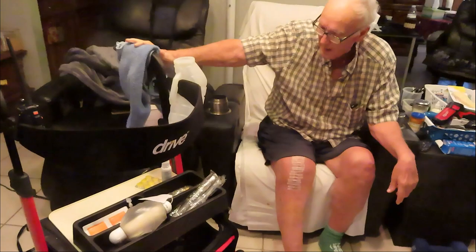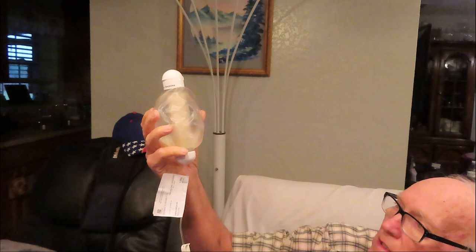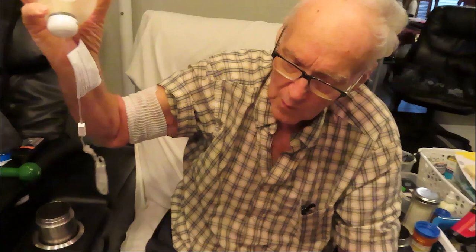I have to take an IV, which I've never seen one before until now. Instead of the IV hanging on a stick like that, it's under pressure of some sort. You open it up. I have a PICC line that goes here, goes up my arm, around, and goes in my heart. You hook it up to clean it out, hook it up and everything. I have to have one of these every day for 6 weeks total.